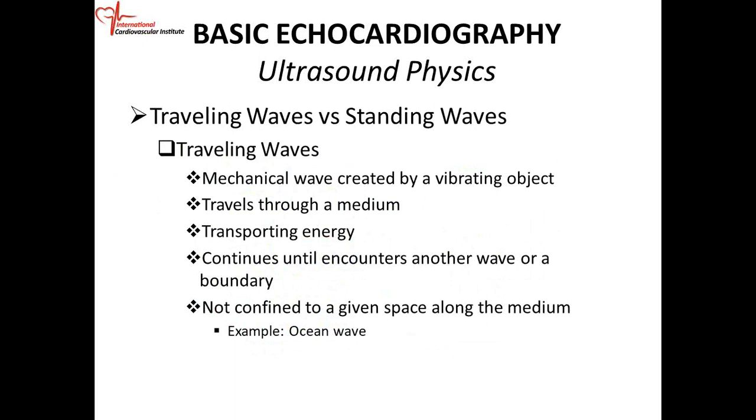So when we do ultrasound of any structures, we plug our system in. You have the vibration of your quartz, your piezoelectric crystal. The vibration of the crystals creates the sound wave.